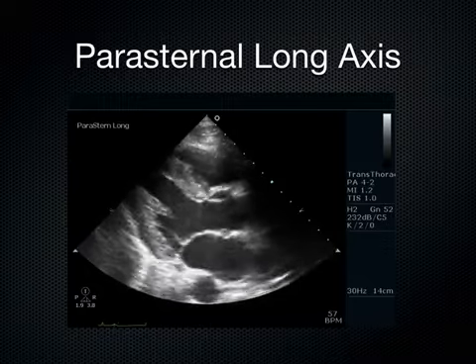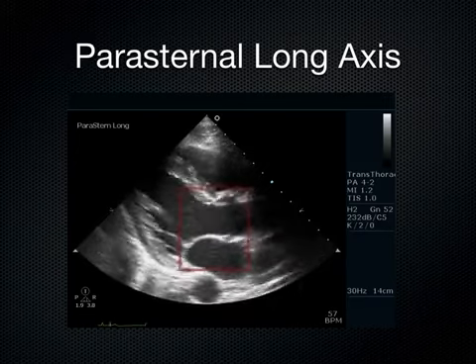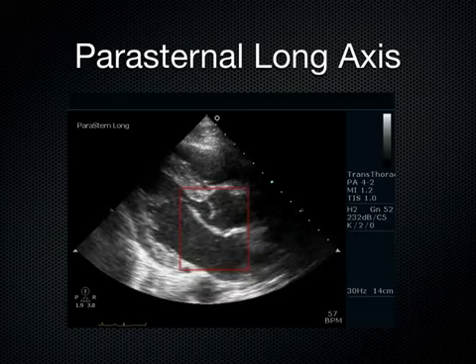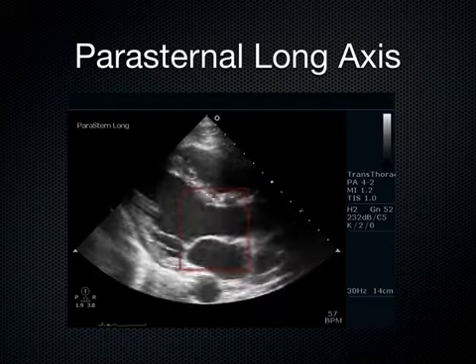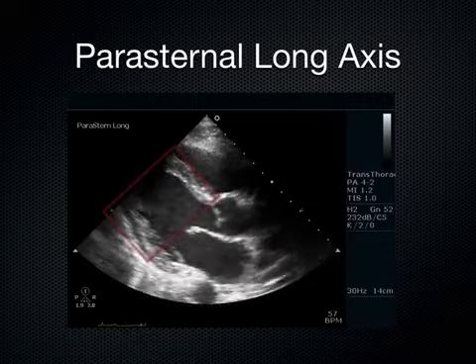If their blood pressure was 70, I'm looking at that mitral valve, I'm saying, yep, coming up and smacking that septum right there. See that? Right there, actually. And you could do that in your machine. You can freeze the machine, and you can back it up or go forward with it. You're going to do that today quite a bit. So there's that mitral valve smacking that septum. Now, we come over and look at that interventricular septum and its movement towards that left ventricle.